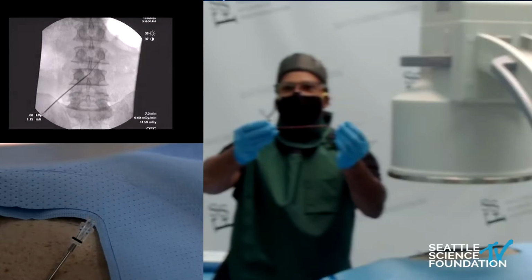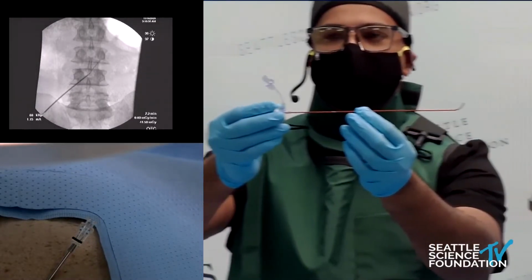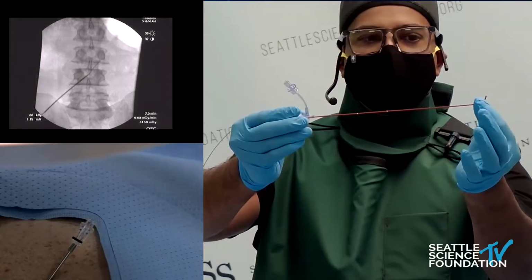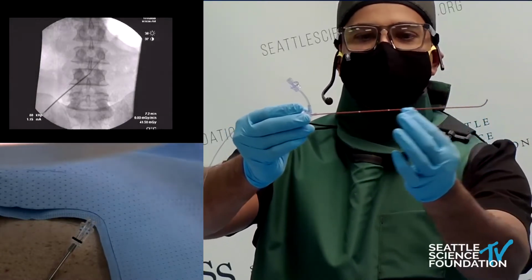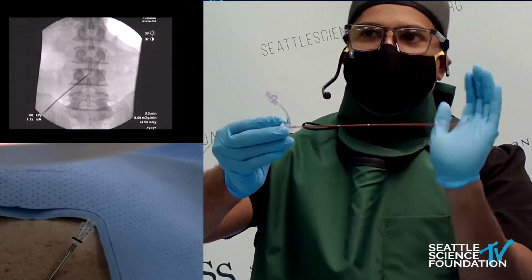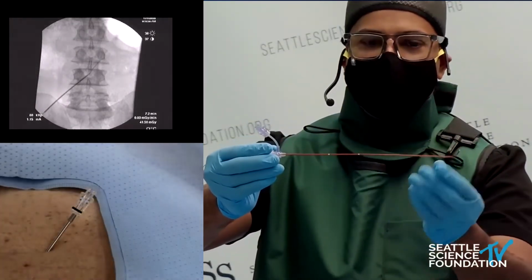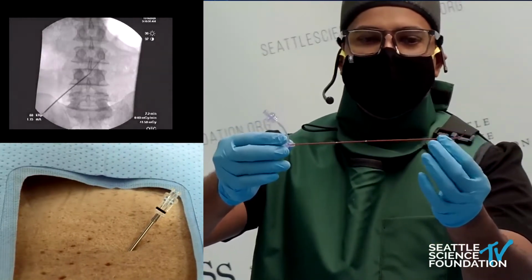Right now I'm blurred, but basically what I want to show you here is this sheath lead system. As you can see here, there's a curve, and in each kit you'll receive one with a large curve and one with a shallow curve, okay? And this is really the delivery mechanism to create the curves and ensure that the lead stays dorsal, right? We're not trying to stimulate the VRG. That's a joke. There is no VRG. We're trying to stay dorsal, right? Because we only want to affect the sensory afferents.